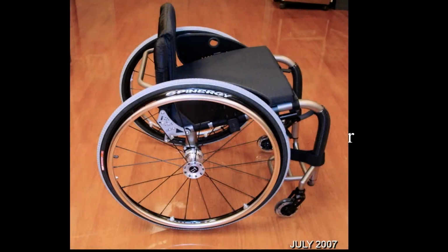And this is my chair. It's a Tilite ZRC actually. At the time, Tilite's fork wasn't wide enough to accommodate a soft roll caster, so I just got the Light Up rollerblade caster, which I wasn't too keen on, so I cracked the magnet out of the hub so it didn't go flashing around. And I figured, oh, that's a good caster, it'll last me a long time.